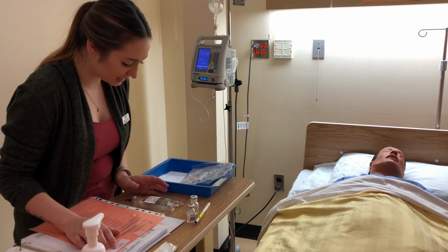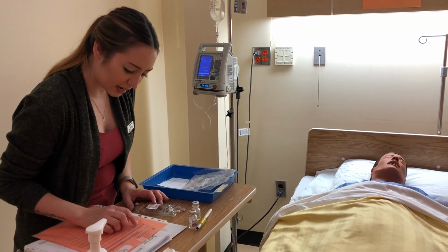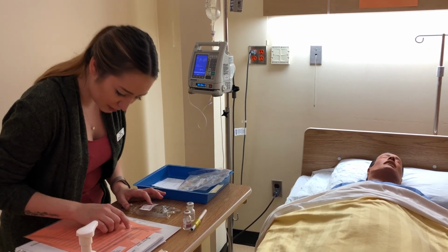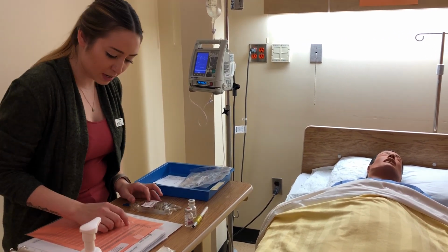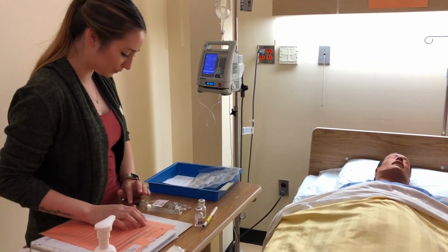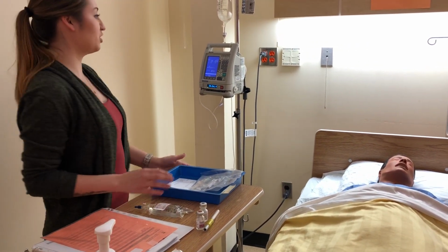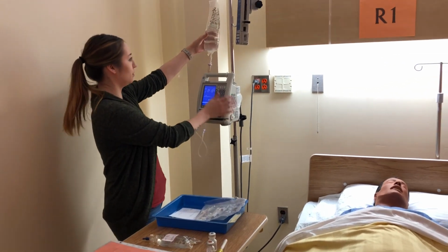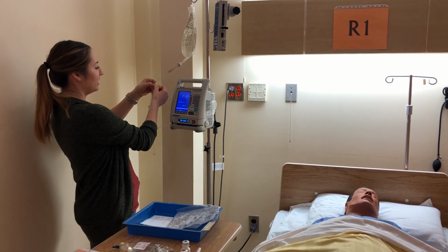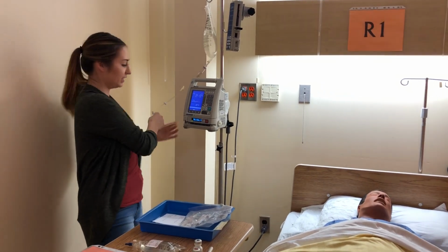Right patient is Emma Wrightson. Right drug is methylprednisolone. Right dose is 75 milligrams. Right route is IV. And right time is every 6 hours, so it's due now. So before I continue, I'm going to just check my primary infusion. I'm going to check the label on it. It was hung at 8:35 this morning, so it's still good.